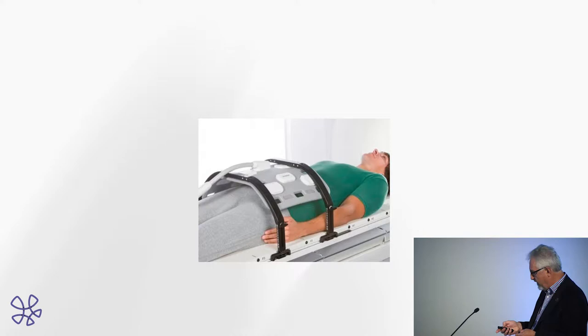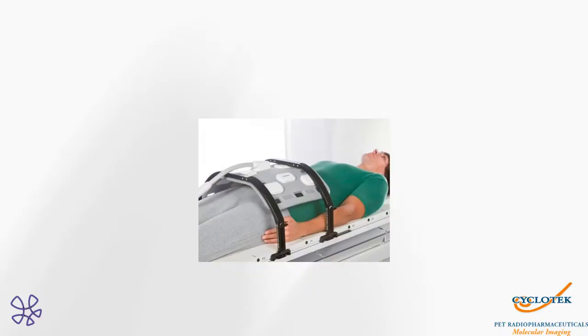But as I mentioned before, the prostate's a difficult gland to image, so we have to try and make things easier. So we actually put what we call these receiver and transmit coils on. So this obviously is a woman. I'm not quite sure why she is in this picture because we're talking about prostates, but anyway. Sometimes the materials are, you know, even doctors can spot the difference. Anyway, here we go. So we've got the prostate coil on her, okay? And so we've got it close up so we get a better signal. As I said before, it's hard to image, but we try our best.